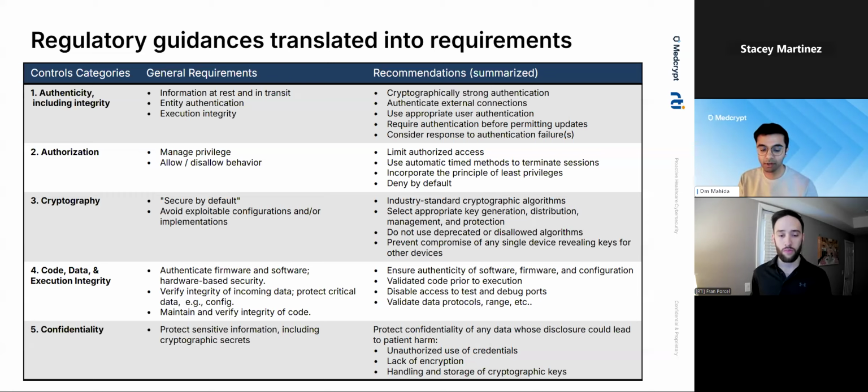One of the key things you don't want to do is have your data go in plain text, because that can make it easier for anyone to do a man in the middle, right? Look at the control data or even patient data that's being transmitted. And also, while it's kind of easy to encrypt data, you could say, oh, I'm going to use a key or a certificate. I'm going to sign the data.